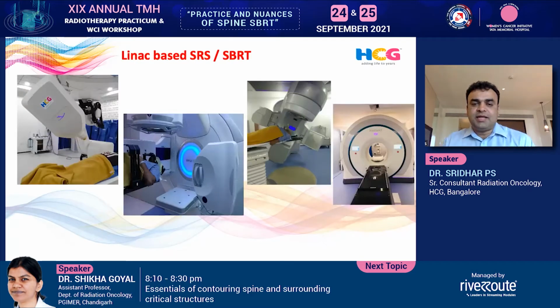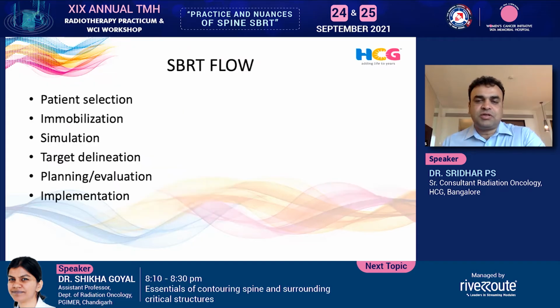So we are aware of that. These are the LINAC based SRS SBRT machines, starting from what I can call my baby, the CyberKnife, and Versa HD or any of the machines on the Elekta or Varian platform or Radixact. These are the machines we have already come across. And the setup has to be good enough to take care of an SBRT program.